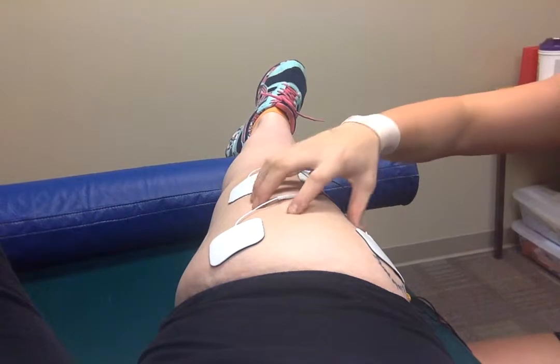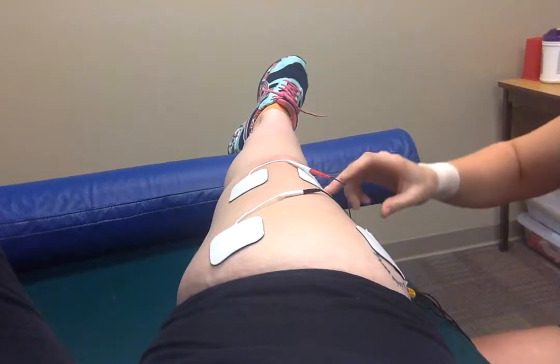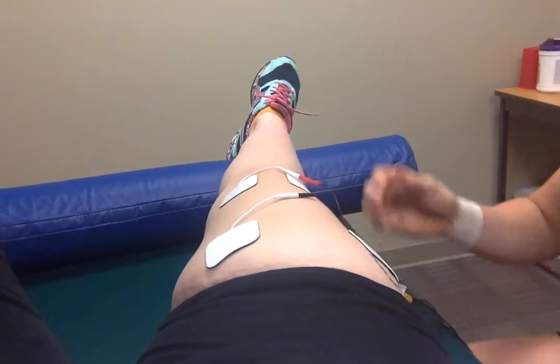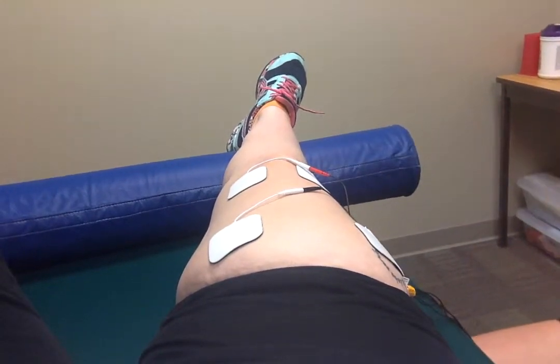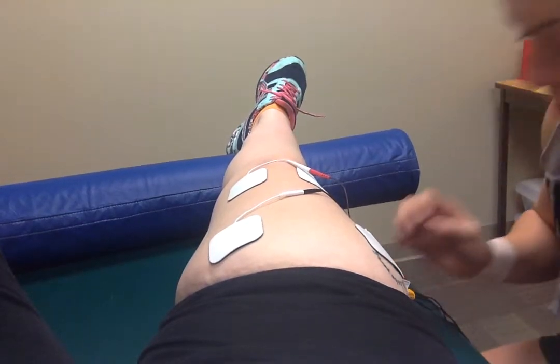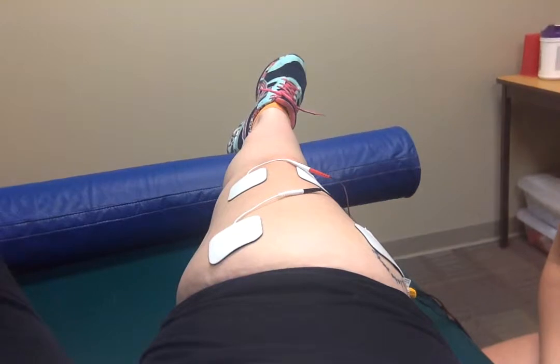I'm not going to actually turn it on, but when the machine is on it's going to help contract these muscles. While that's going on, we'd have our patient try to contract with it and pull their leg down, so their leg should be coming more into a straightened position.